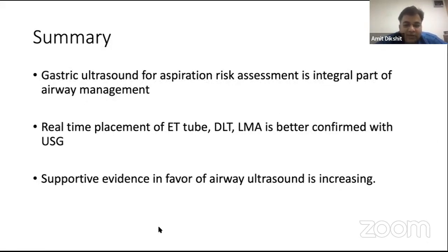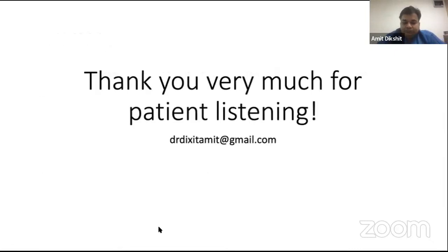Real-time placement of ET tube, DLT, LMA is better confirmed with ultrasound, and especially since you are in a teaching institute, there is a large supportive evidence in favor of ultrasound. So thank you very much for your patient listening.